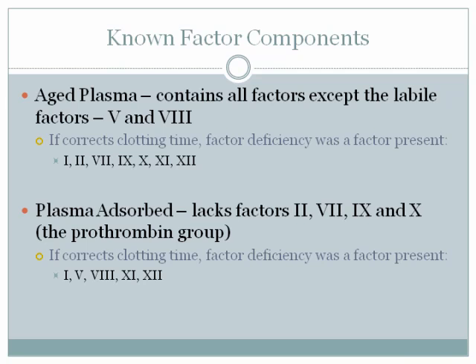Normal PT, prolonged APTT, corrected serum, corrected aged, no correction on the adsorbed. Okay, let's take a look. And it should be factor 9. Awesome. So do you guys feel more comfortable with those kind of scenarios?